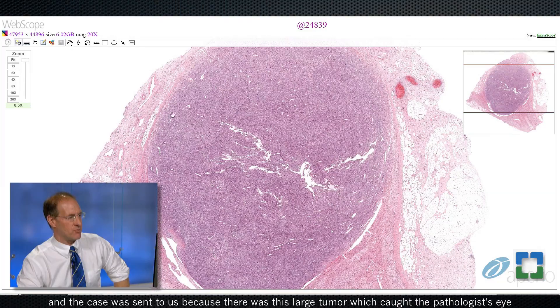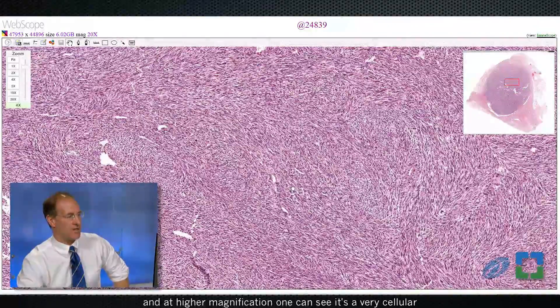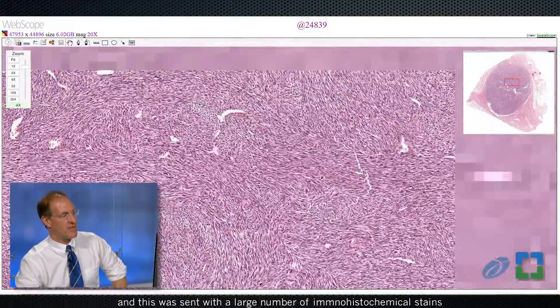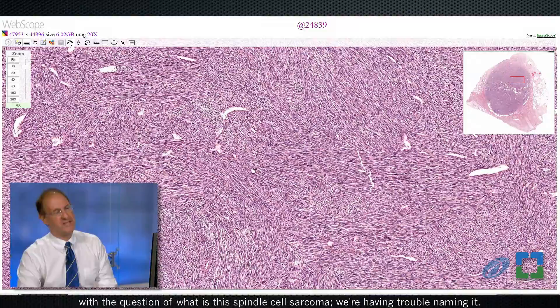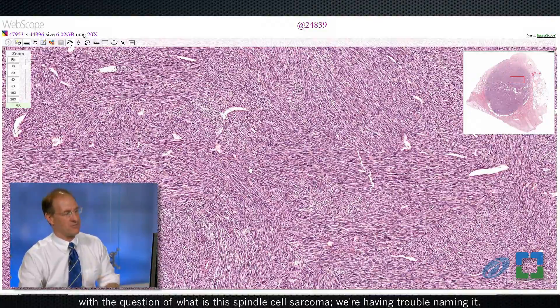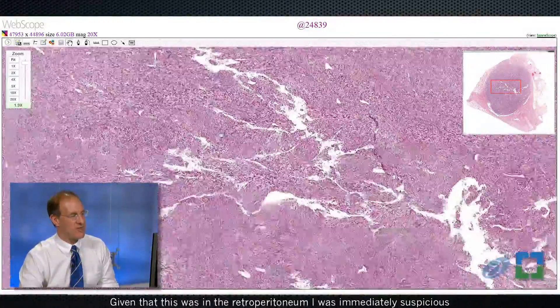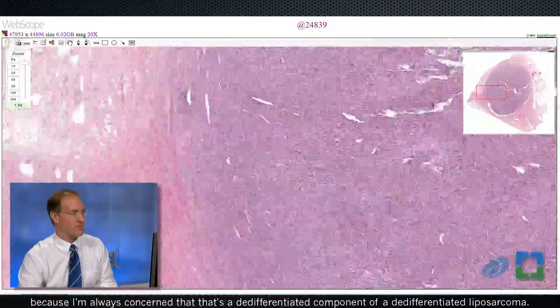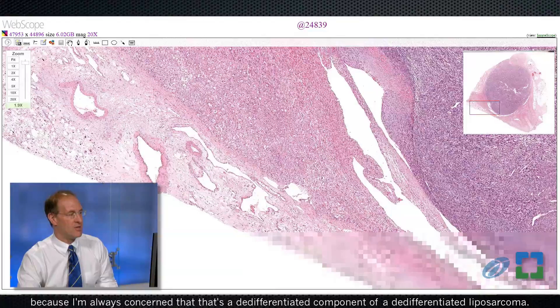The case was sent to us because there was this large tumor that caught the pathologist's eye. At higher magnification, one can see it's a very cellular spindle cell neoplasm arranged into fascicles. It was sent with a large number of immunohistochemical stains with the question: what is this spindle cell sarcoma? Given that this was in the retroperitoneum, I was immediately suspicious and didn't really care what kind of spindle cell sarcoma this was, because I'm always concerned that it's a de-differentiated component of a de-differentiated liposarcoma.